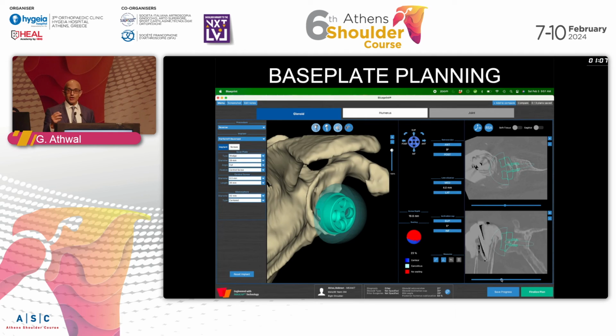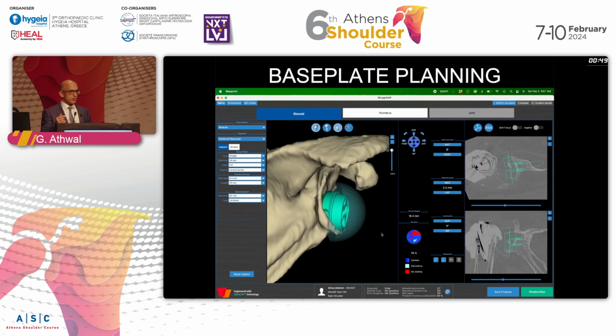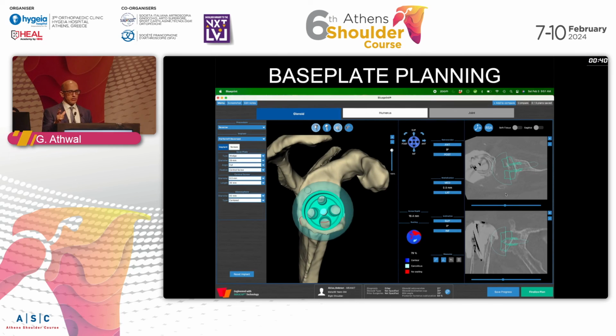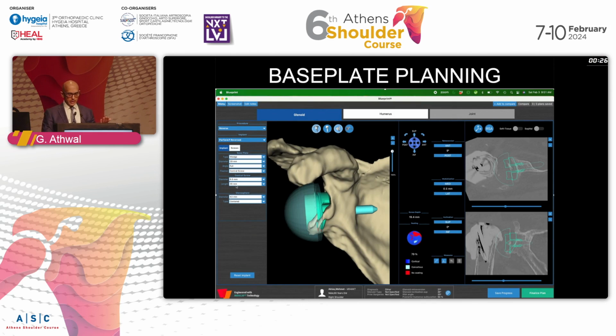And historically, I've always said -10 degrees, so maybe -15 is okay now of retroversion. And now with inclination, I think with bone loss, I really make an effort to try to get it at 0 or -0. So here we're going to switch it down to 0, and then I'm going to medialize. And I'm looking for greater than 50% as the absolute minimum, but if I get 70 to 80%, that would be better. So here we get up to 80% backside seating. But because I had to ream to go medial, because there's only one size augment here, I had to adapt the augment to this patient's particular deformity, and I've had to medialize, so then I want to get back lateral, and the only way for me to get lateral using this augment is to use a lateralized sphere. So in that case, I'll go ahead and lateralize based on the sphere.